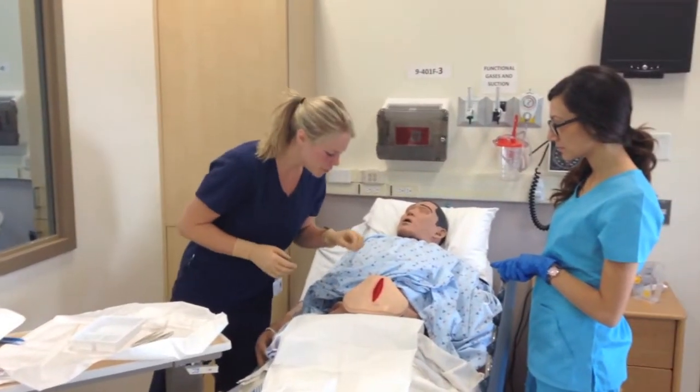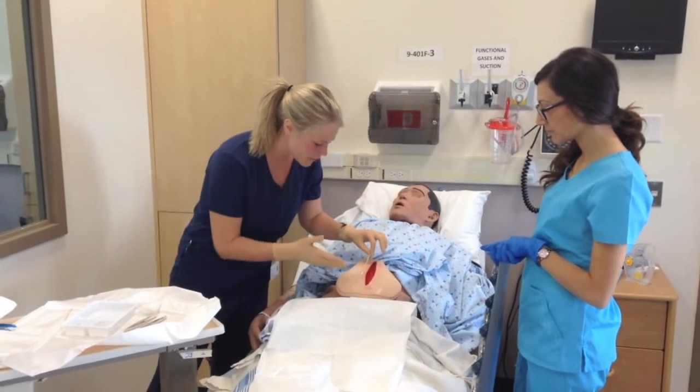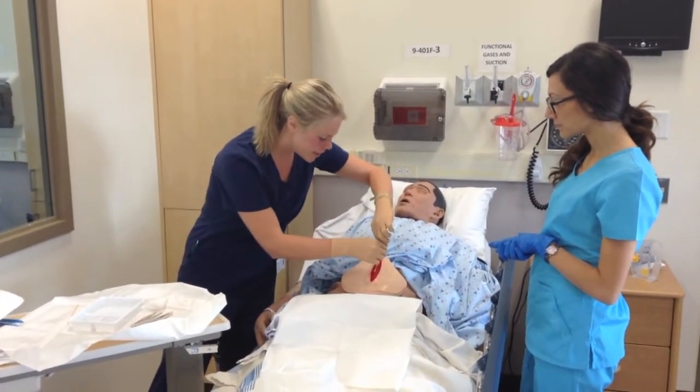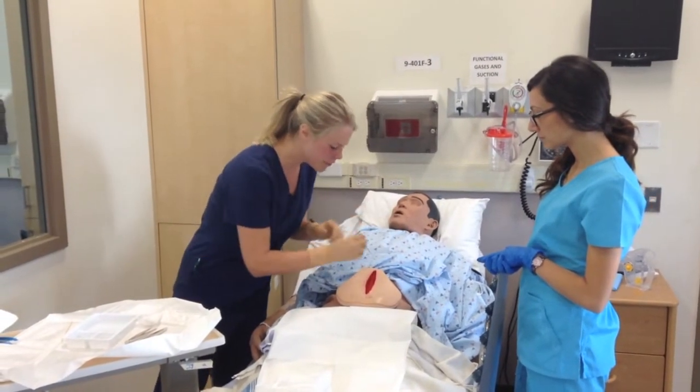So we're just going to take a look at the wound, see how long it is. It's about the length of a Q-tip, so I'll just make note. And then we'll see how deep it is — about an inch deep. And I'm just going to check around for any tunneling.